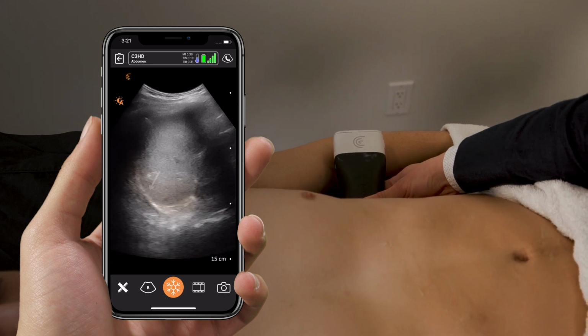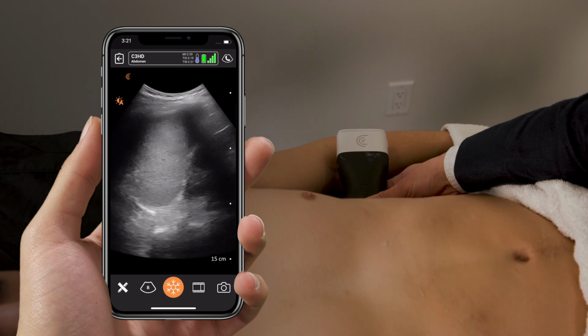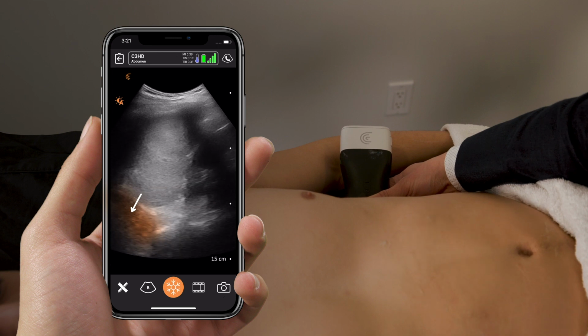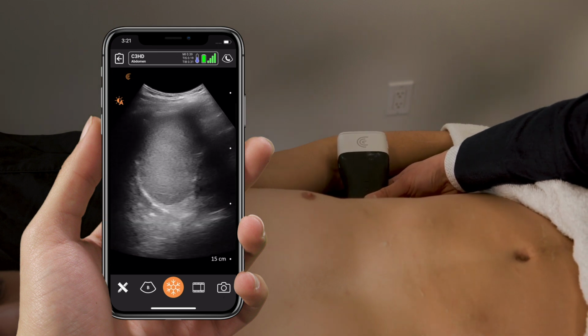So it's important to visualize the diaphragm up to 9 o'clock, and we'll sweep through that interface as well. We'll also try to angle our probe to look above the diaphragm to again see if there's any fluid in the left chest, suggestive of a hemothorax.